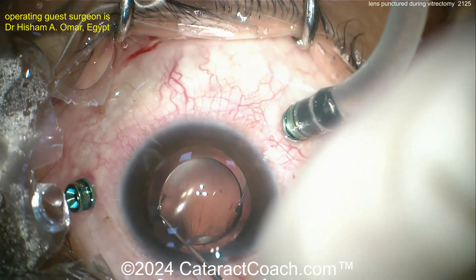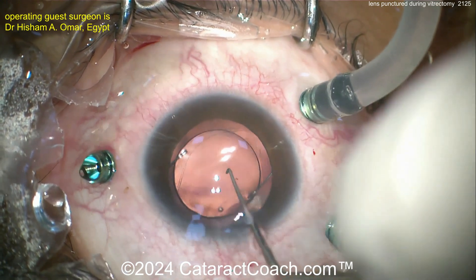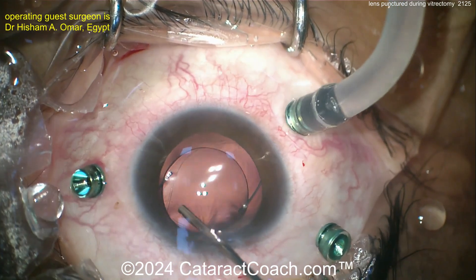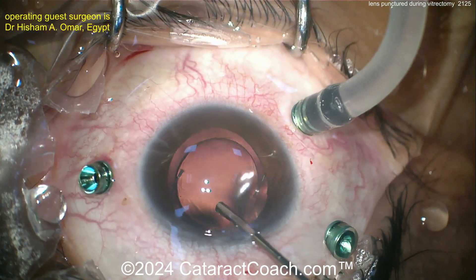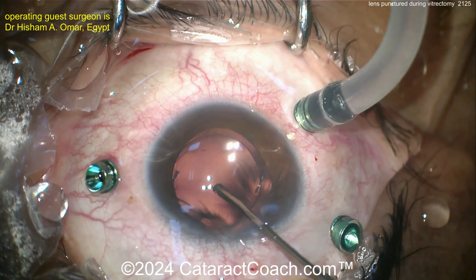Can you get an optic capture behind the capsulotomy? Just be careful — it's not a capsule rhexis, so this capsulotomy can run out a little bit. But that's a pretty good capture. Nice position — there it is, behind the capsulotomy edge, with the haptics definitely in the sulcus.